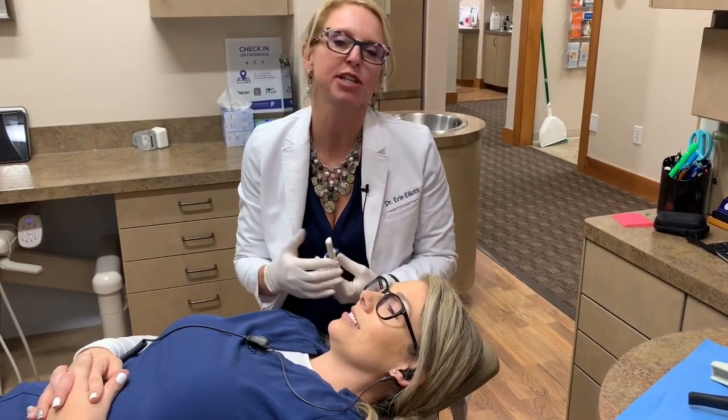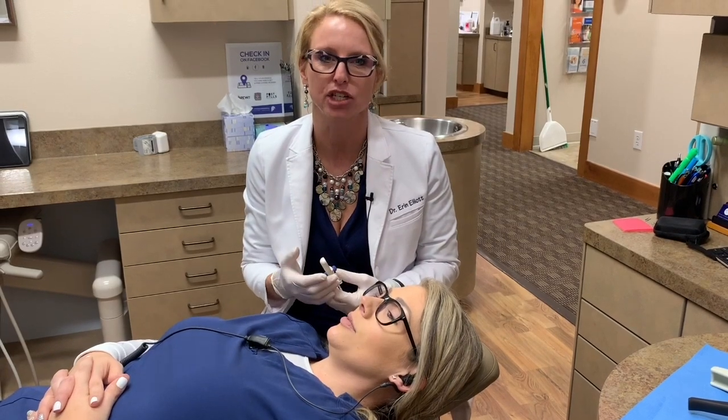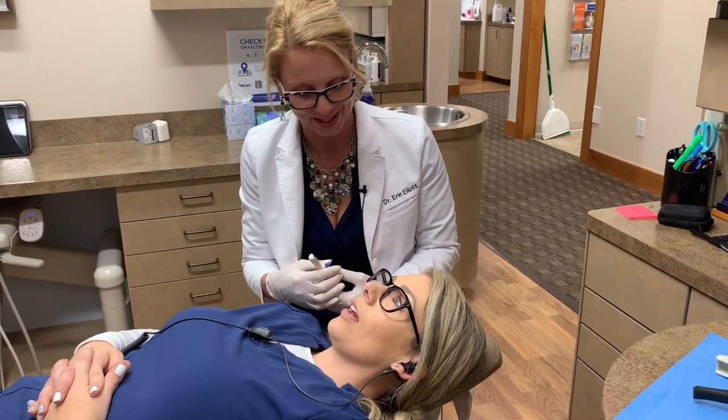When I lay the patient back, we just have the patient do a snore noise. Can you go ahead and give me a snore noise for me?